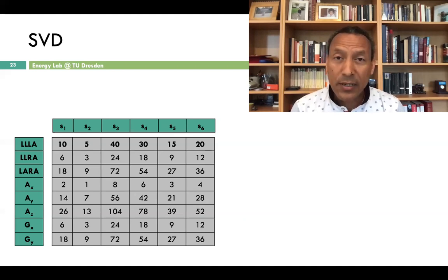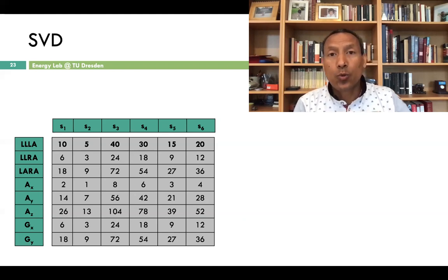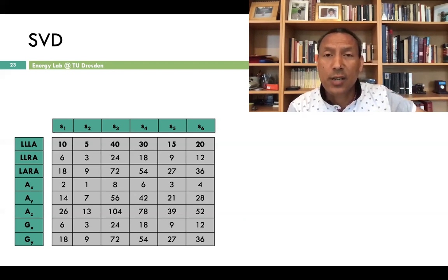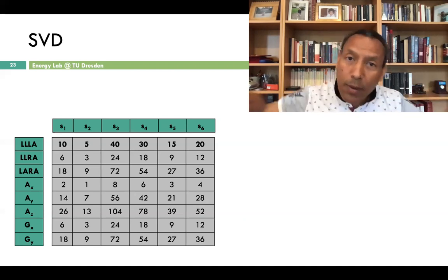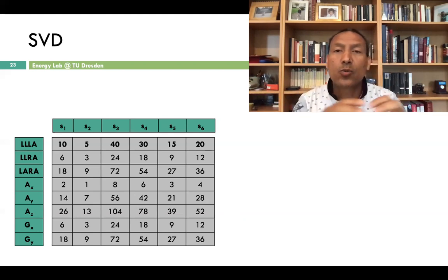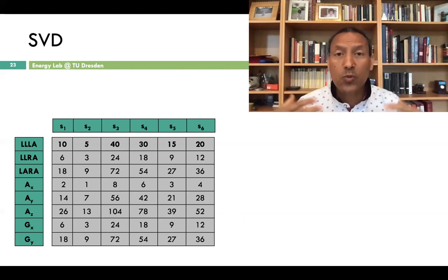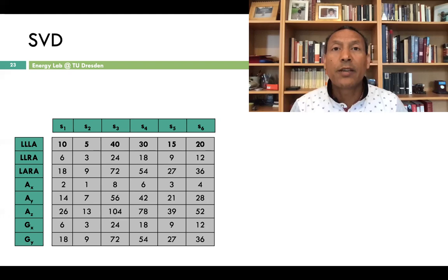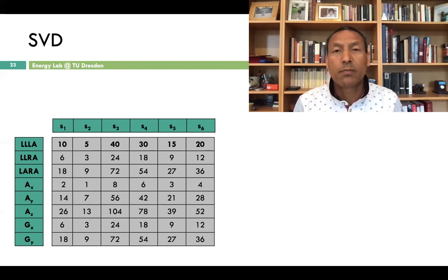Now, with the use of SVD, we can decompose the raw data into a highly correlated ECG signal and an uncorrelated independent motion signal, which has nothing to do with the ECG. Because the ECG and the motion have nothing to do with each other. The motion is produced because I move. The ECG is produced as a result of the underlying electrical conduction system of the heart.